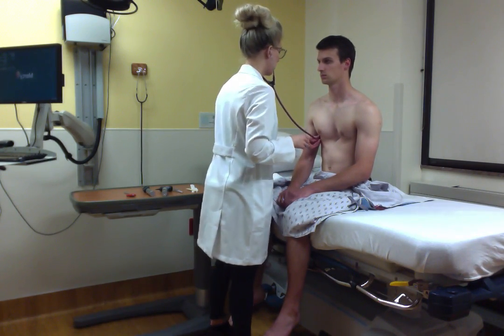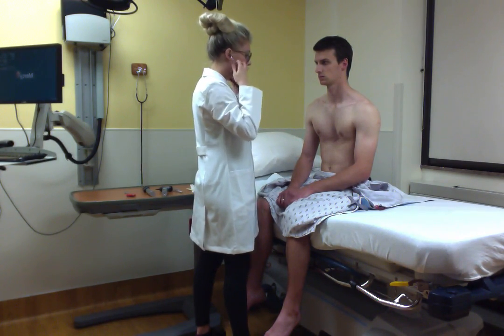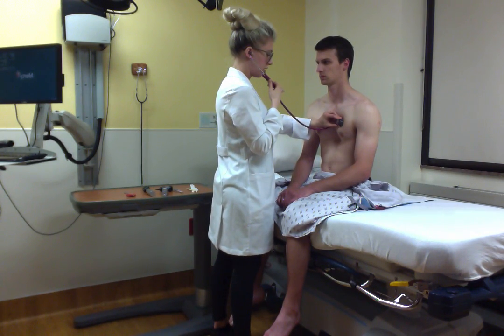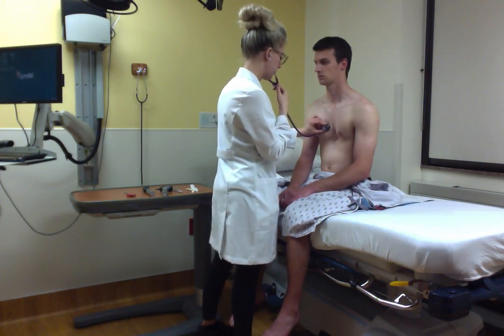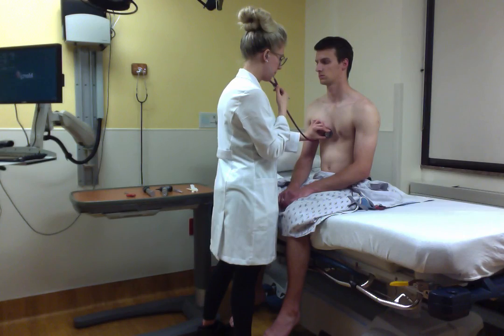Okay, you can just breathe normal. Next, I'm going to be listening to the heart tones. First, listening to the aortic valve. The pulmonic. Erb's point. Tricuspid. And the mitral.